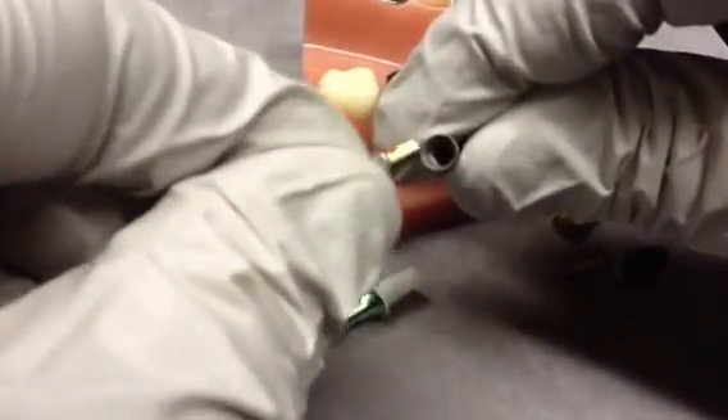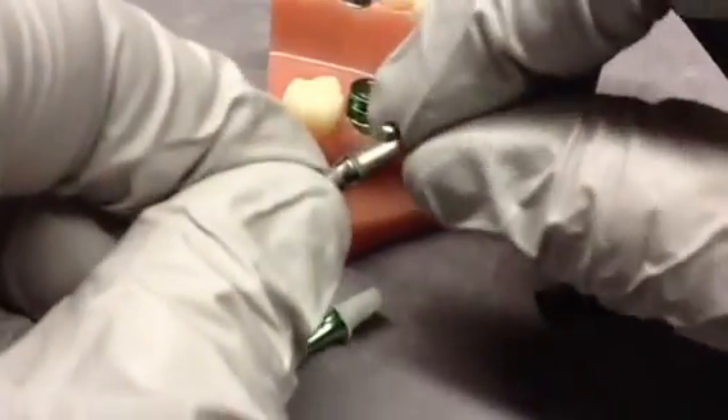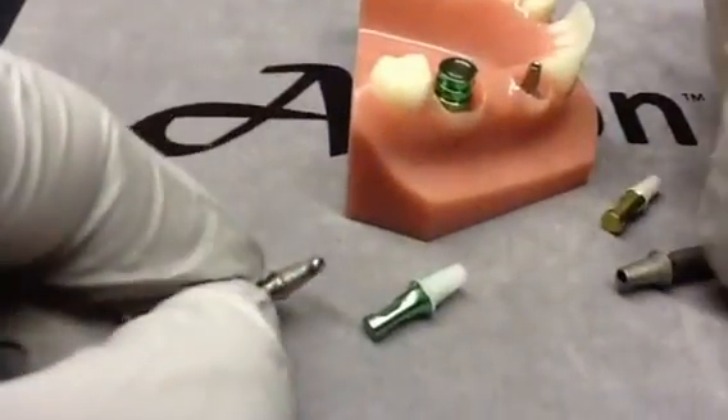You can see the pristine margin on the final casting, and regardless of the material that's used, you actually get a very snug fit.